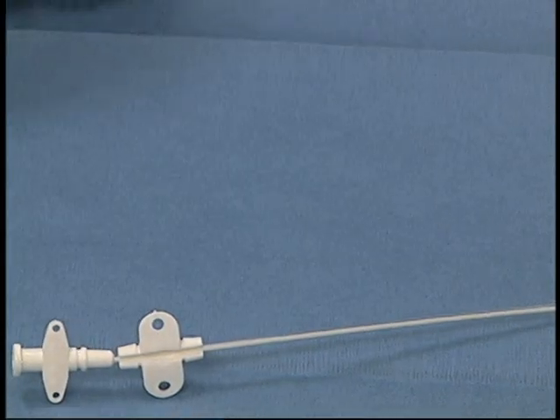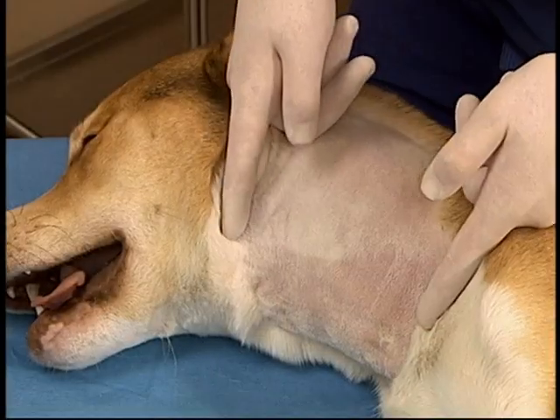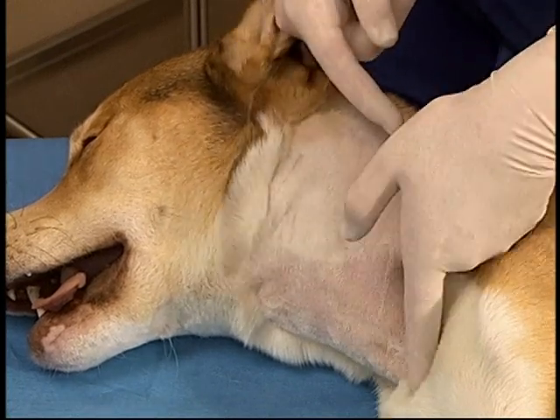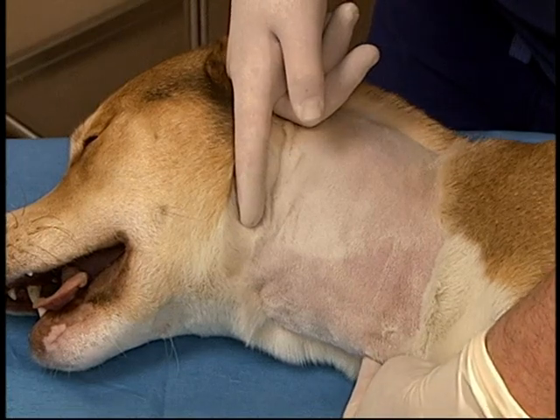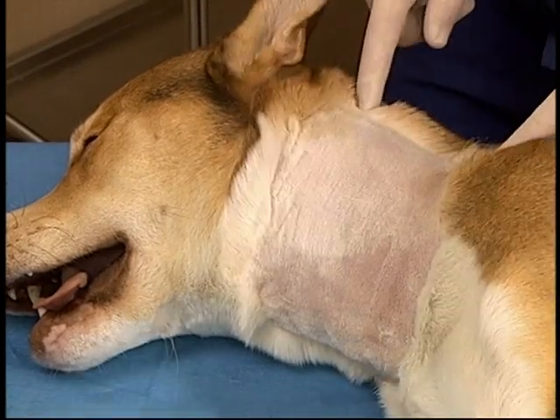Once the catheter is completely in the vessel, it will be sutured in place. The animal is clipped, surgically prepped, and drapes are placed. The drapes are being left off for visualization purposes. The clip should extend from the dorsal midline to lateral to the ventral midline and from the angle of the mandible to the thoracic inlet.